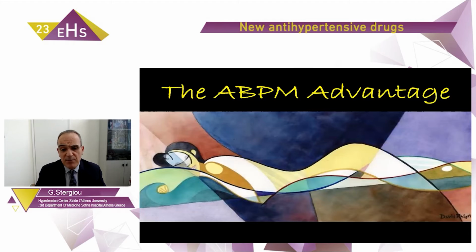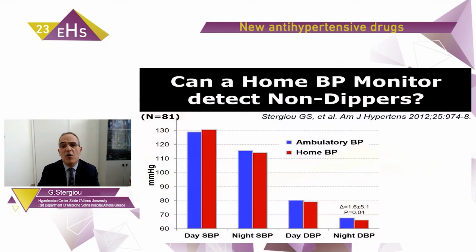But ambulatory monitoring has a unique advantage, and this is the 24-hour blood pressure curve, and ABPM is regarded as a unique tool to assess nighttime blood pressure and dip. However, this is not the case anymore because there are several home devices that can be used during the night for 2 or 3 days and take 3 readings every night and can detect non-dippers.